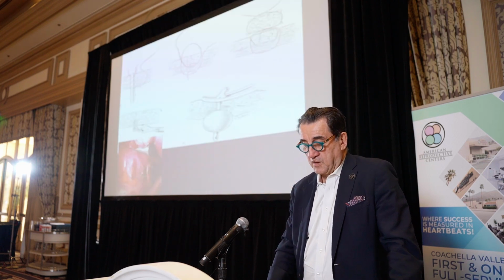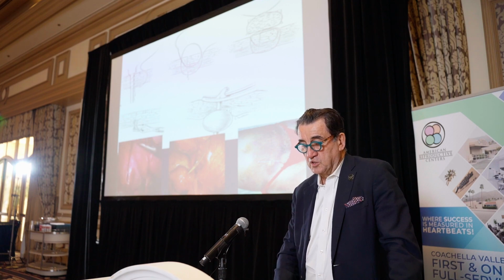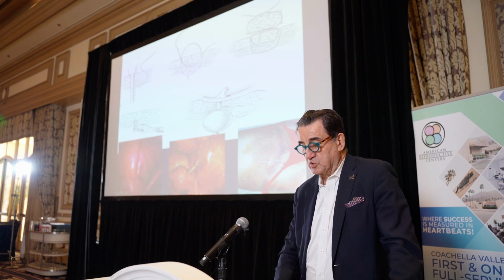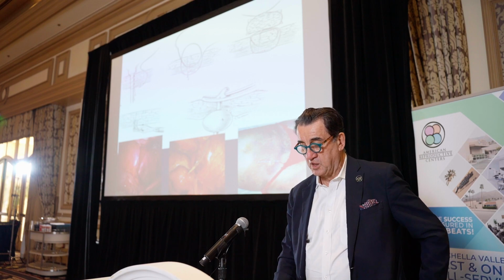If you ever get in the situation where you hit those vessels, those bleedings can be quite dramatic. I mean, it's a big bleeding. Then you can either take a large needle and tie it under and above, or you can try to put a Foley catheter through the trocar and inflate it and pull it back. It doesn't really work well, never for me.